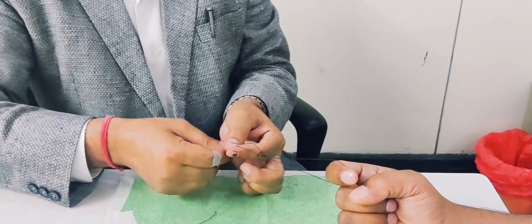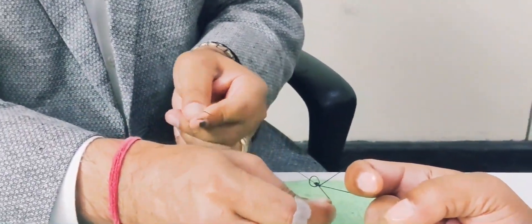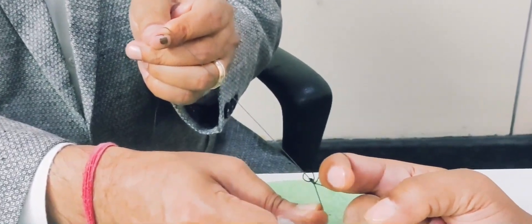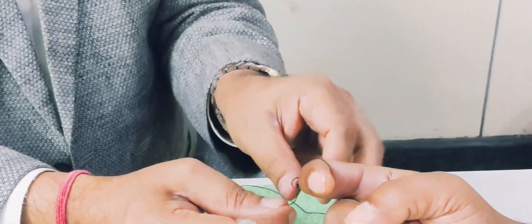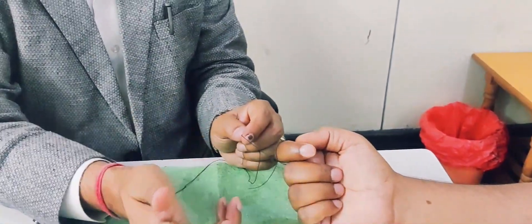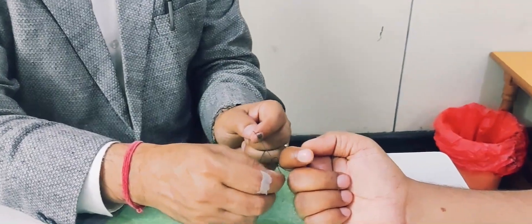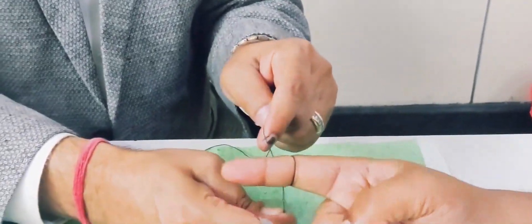And this knot is going to move. So you see this is moving, this is going to the vessel. And you can use this to ligate the appendix, you can use this on cystic duct, you can use this wherever you think this will work for you. You see the pressure effect. Can you show the pressure effect right here?